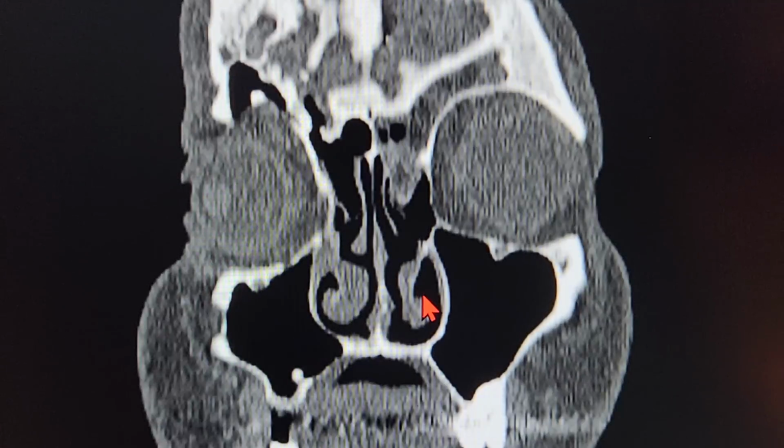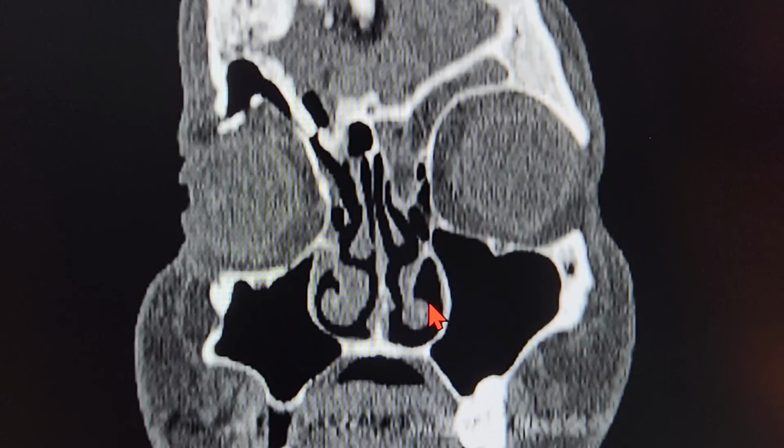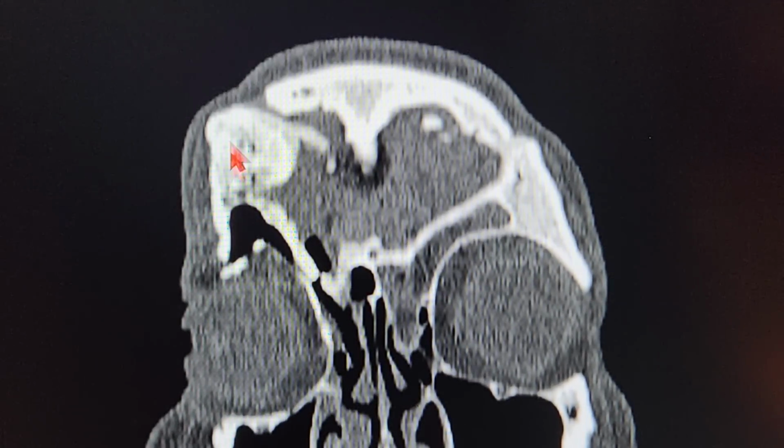This patient was operated twice transcranially. You can see over here, this is the cranium. Now, following the RTA, there was definitely some kind of skull base fractures. This was done 10 years back. Okay, the first intervention was done 10 years back. That's a lot of time, right? And the second surgery was done, I think, in a span of a year or two.